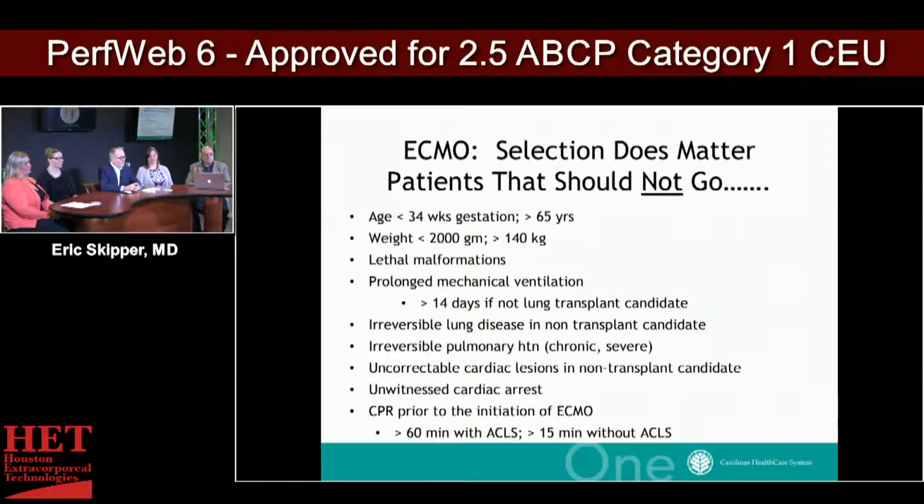Irreversible lung disease in a non-transplant patient. There's no end game. Irreversible pulmonary hypertension, chronic, severe. You need an end game. Uncorrectable cardiac lesions in a non-transplant candidate.